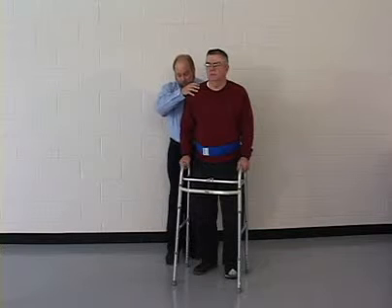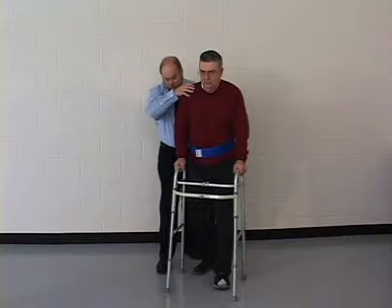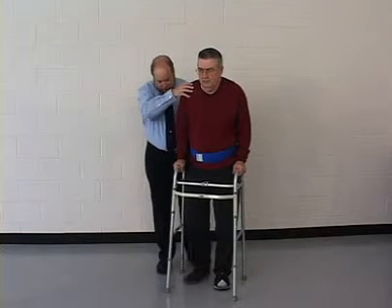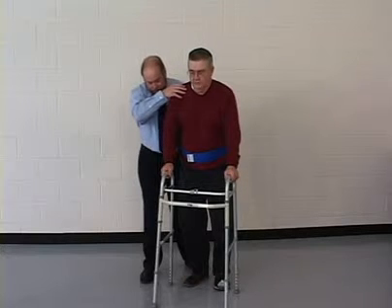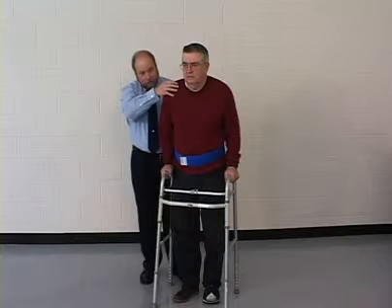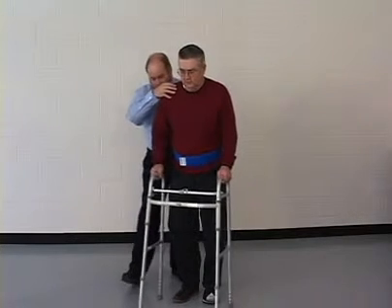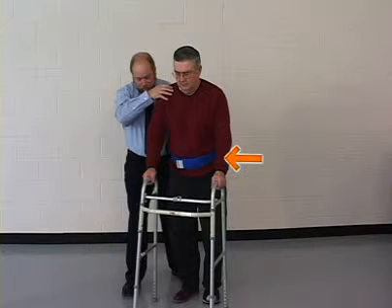Gait patterns define the sequence of moving ambulatory assistive devices and lower extremities so that patients can ambulate. In order for a patient using a walker to ambulate using a three-point gait pattern, the patient stands centered within the walker. The physical therapist must be positioned in stride, behind and to one side of the patient. The therapist grasps the gait belt and the patient's shoulder.